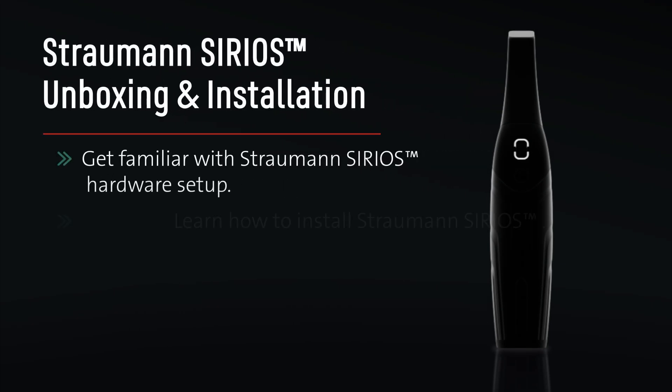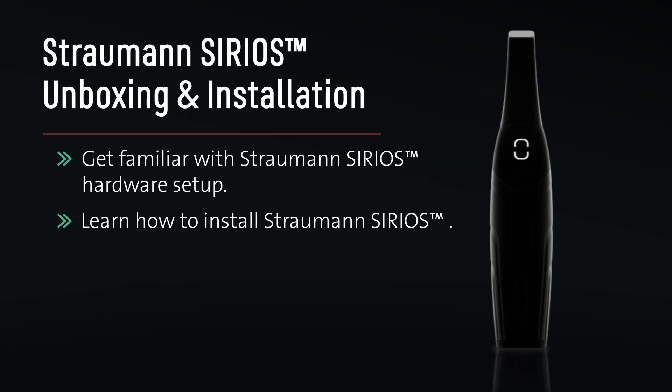Straumann SIRIOS unboxing and installation. Get familiar with Straumann SIRIOS hardware setup and learn how to install Straumann SIRIOS.